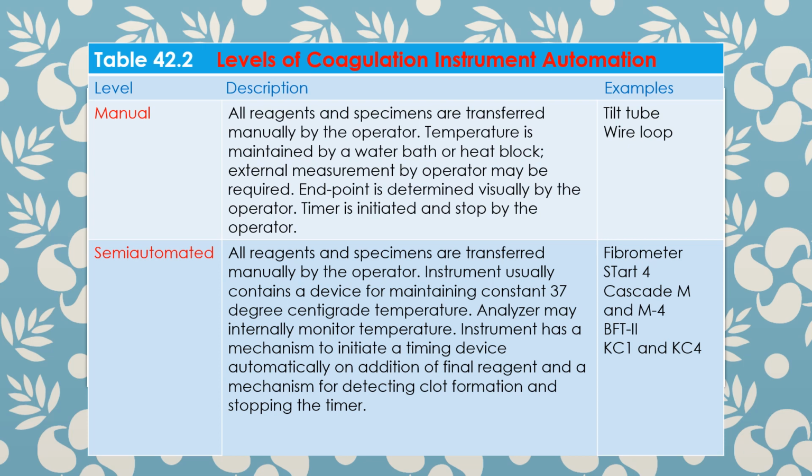For the semi-automated, all reagents and specimens are transferred manually by the operator, same as the manual. But the only difference, this instrument usually contains a device for maintaining a constant 37 degrees centigrade temperature. The analyzer may internally monitor temperature.